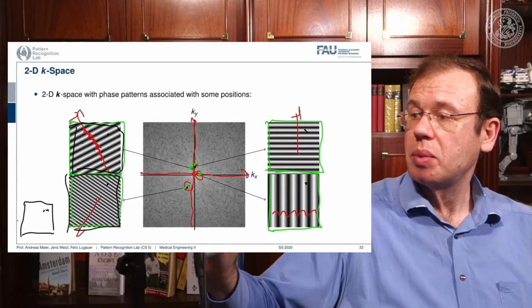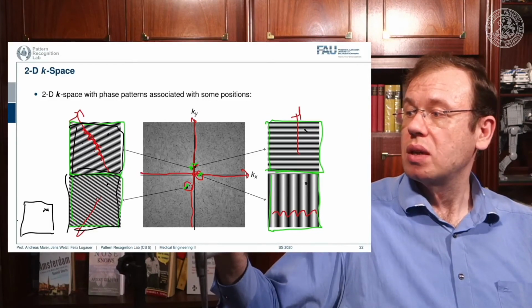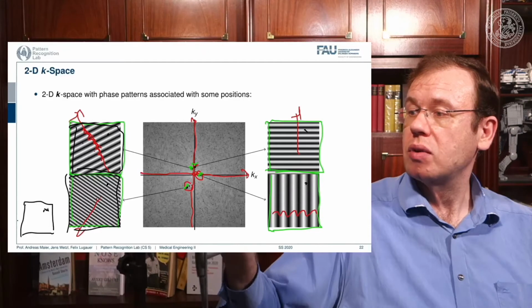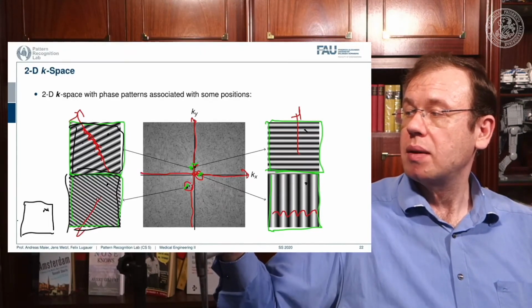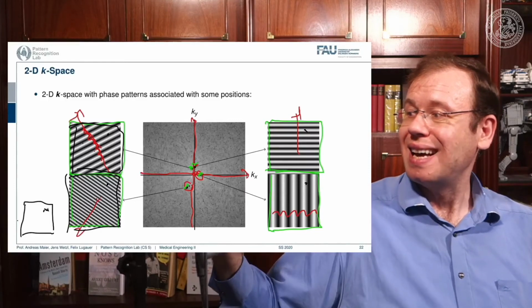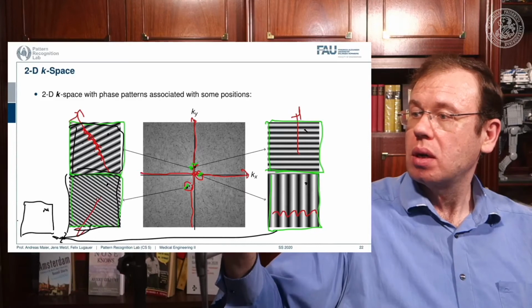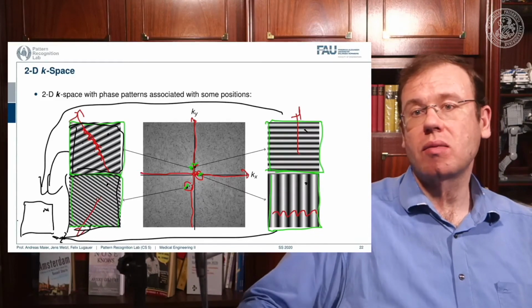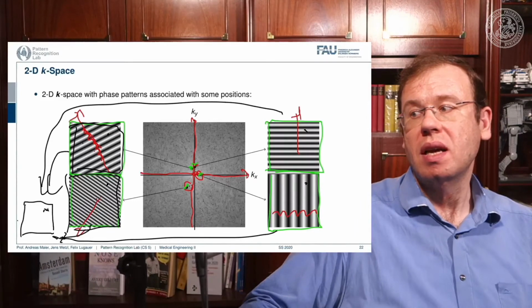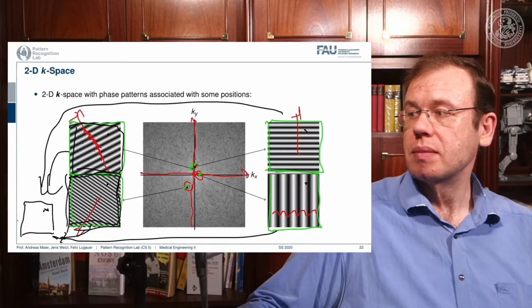and then you sum them up here. This gives you this result. So if I want to go from the Fourier space, I essentially have to instantiate all of these plane waves, I multiply them with the respective coefficient, and then I sum all of them up in order to form the original image. So this would be an inverse to the Fourier transform. So we always need this kind of basis in order to construct it.